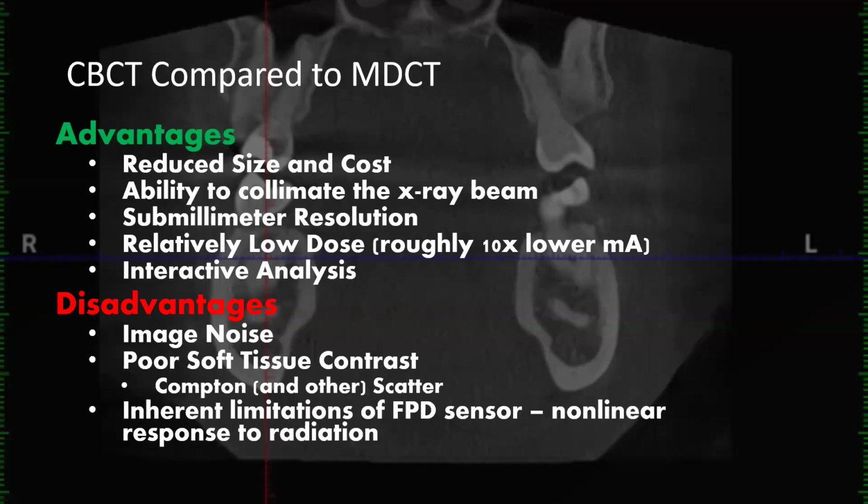And so there's a lot of software that came out that would let you measure the density of bone when you're planning an implant. That's supposed to give you an idea of whether it's dense enough that the implant is going to osteointegrate. But what they found is, since it's nonlinear contrast, those gray level values are not very reliable. To some degree you can look at the pattern of bone, and it may provide some help. Overall, though, you can tell if a patient is osteoporotic. They've been doing this forever, since before CBCT. They look for those signs of osteoporosis in the pano.